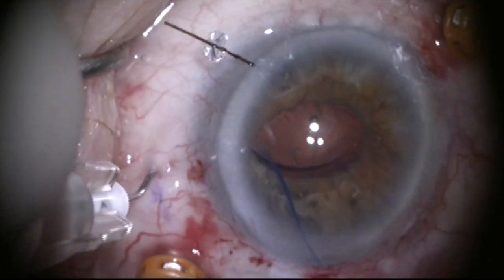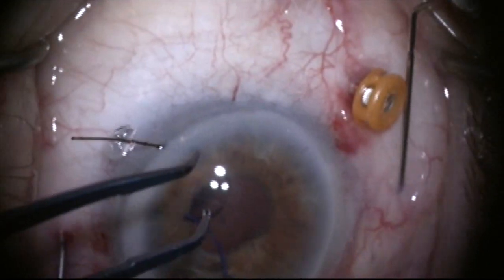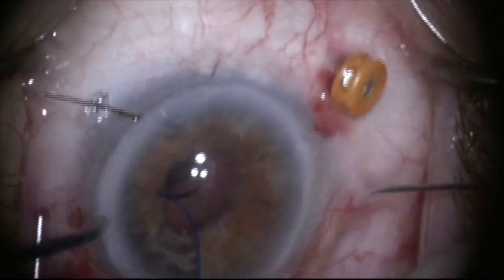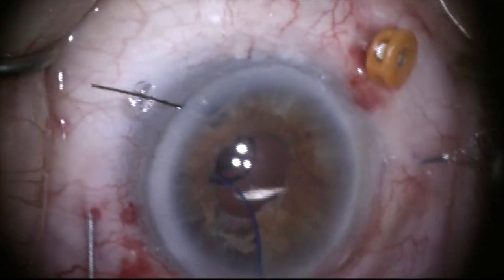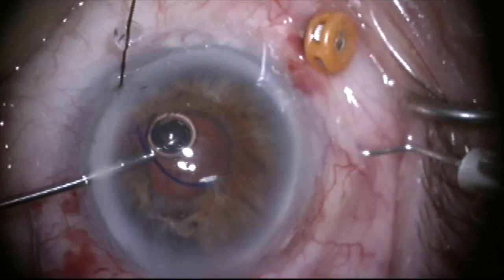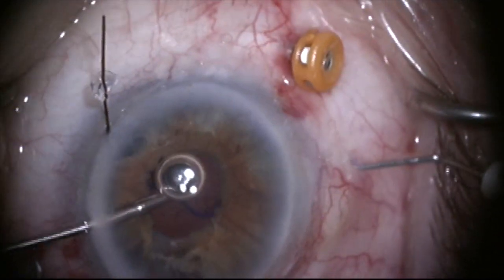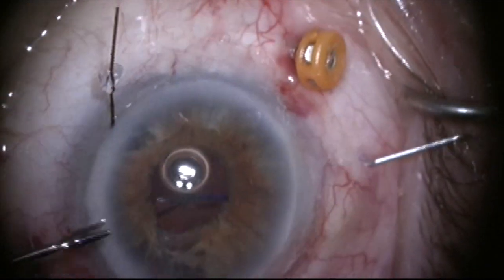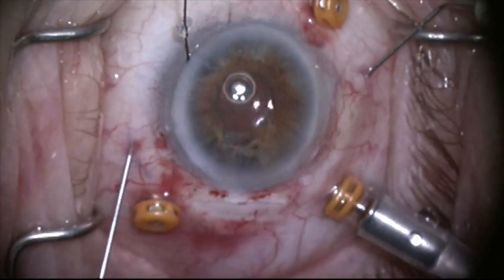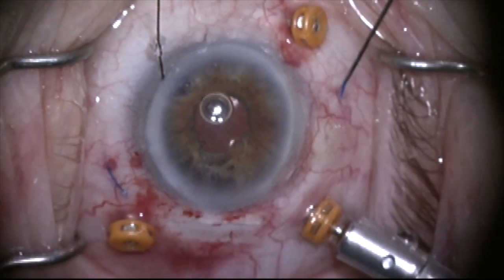I'm now going to do the haptic on the other side. With the 30-gauge needle going parallel to the limbus, angled maybe one or two degrees posterior, I grab the other haptic and tuck it into the 30-gauge needle. Now both haptics will be withdrawn at the same time. I've moved my infusion line to a different trocar so I have more room to work.